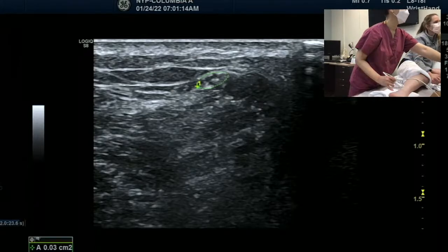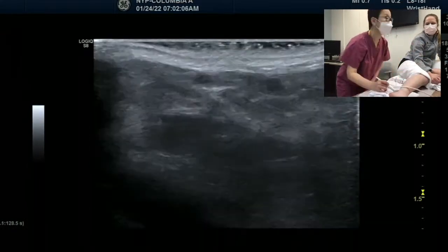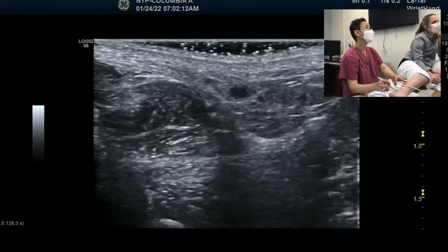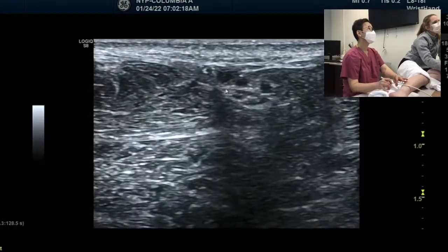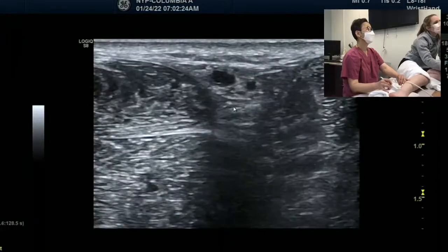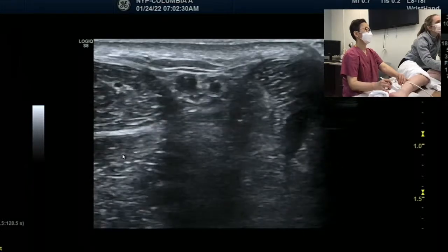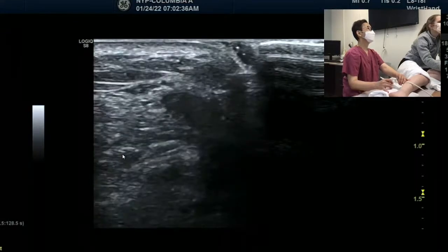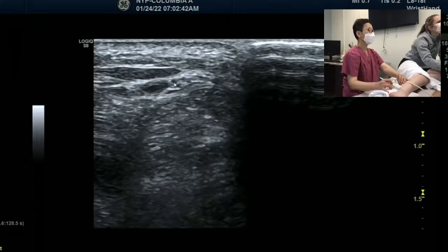So look at this now. Okay, so I'm gonna start from here again. Sural nerve over there, right? Now the round one, the white round one, you see? They move. Look at that. Then I think you have to get rid of the cursor so you can see it. See? Now, moving into, going up to adipose tissues. Do you see? Here. Now, Debbie got it.